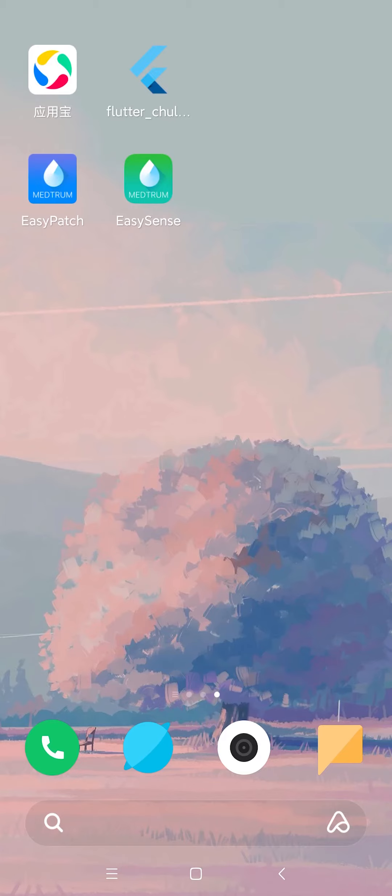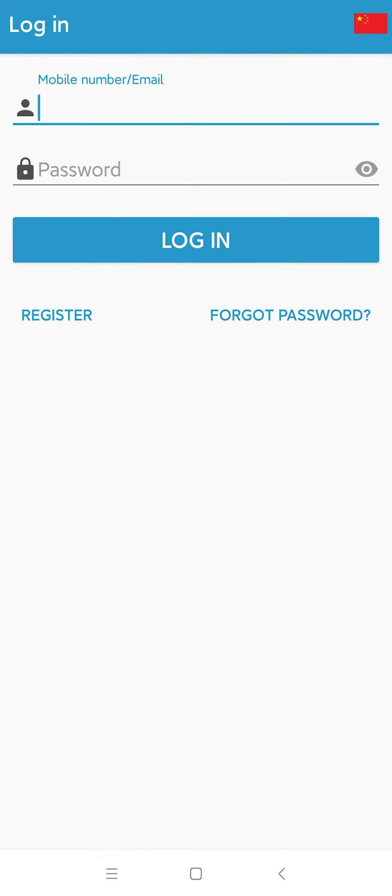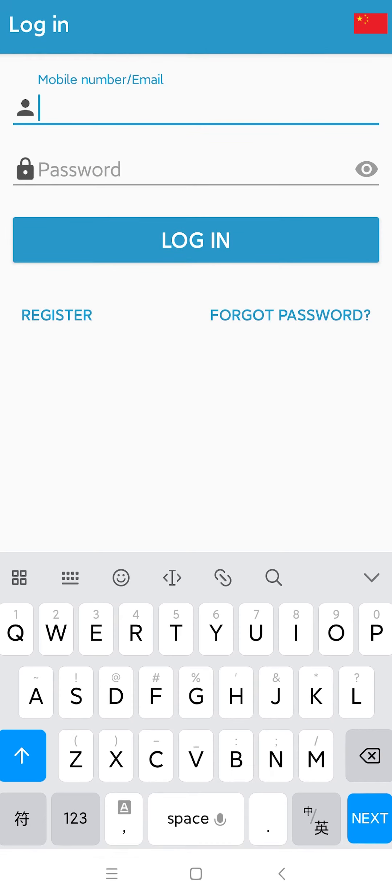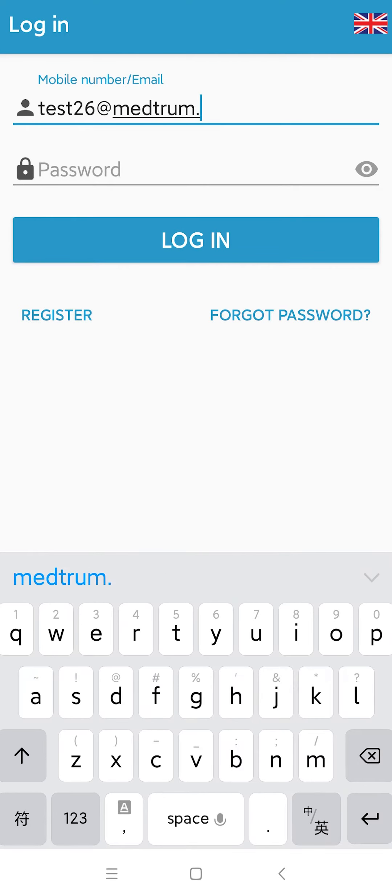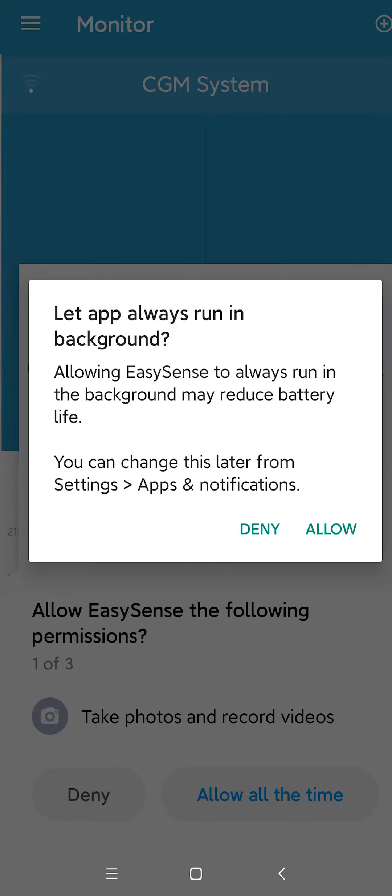How to set up the MedDrom app on your smart device? Open up the EasySense app on your phone. Insert username and password, then click Login.